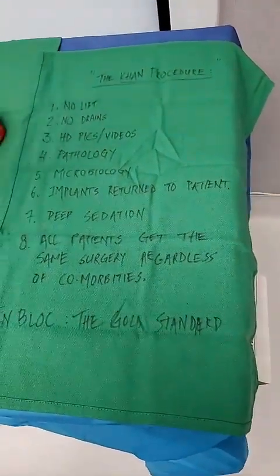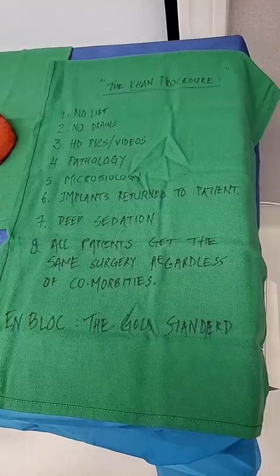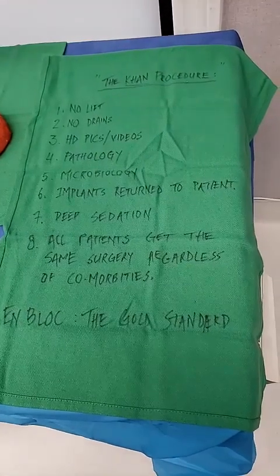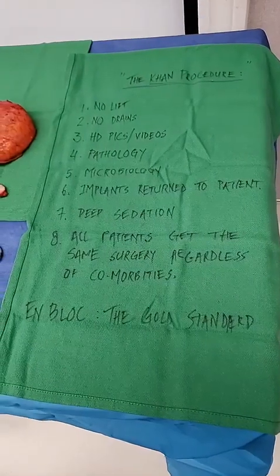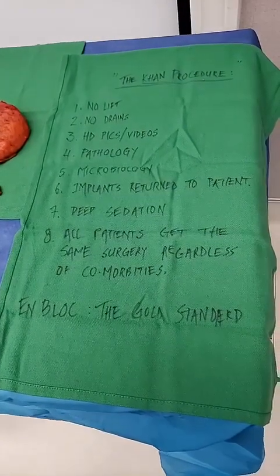No lift. She's so inflamed. It was a very tough surgery, even though she was above the muscle. She's so inflamed that this is not the time to be doing a lift on a 67-year-old, because this is set up for problems like dehiscence, infection. No need for drains. I have not put in drains in any of my patients with intact saline, ruptured saline, intact silicone, ruptured silicone, even in the last now well over 4 years.